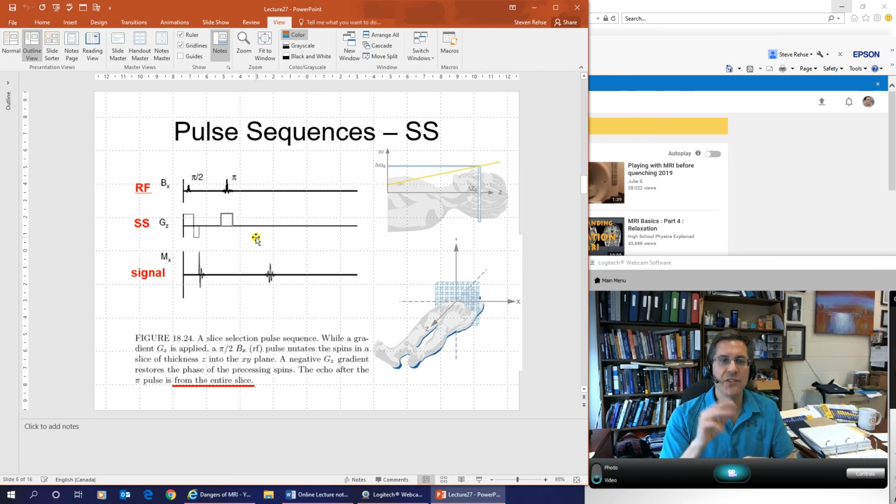All right, so this is a very simple pulse sequence. It's only got 1, 2, 3 lines because it's all that we're really showing here. But you can understand what all of these signals are. I mean, really, it's tricky, but it's not that complicated if you understand what we're talking about. So in this kind of 3-step pulse sequence, I really need you to understand what each row is showing and why the things are where they are.